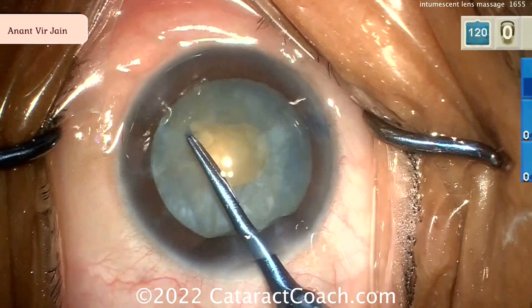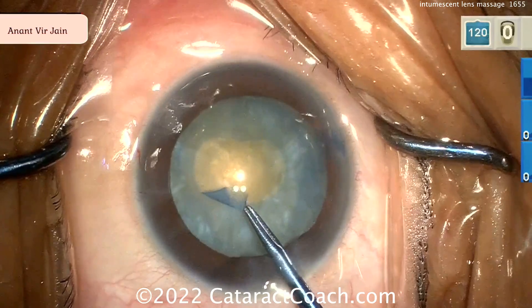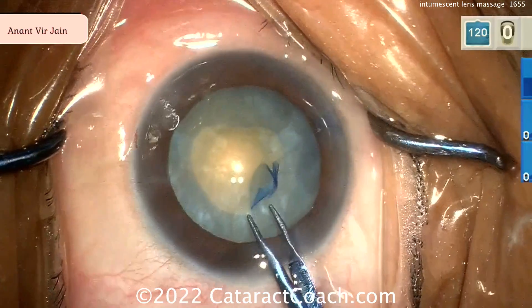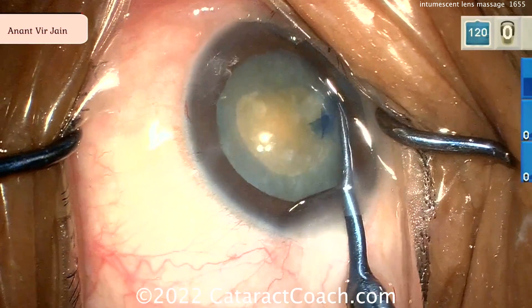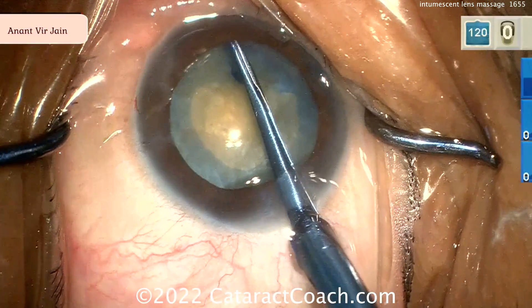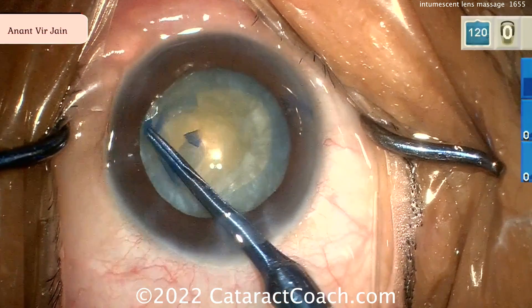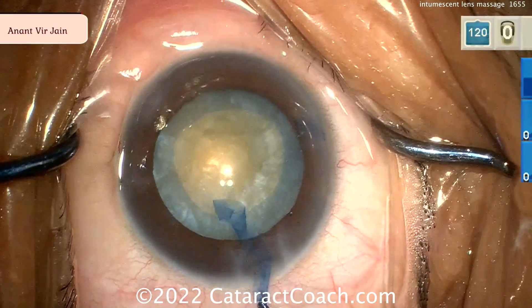Good question — hey, everyone loves a massage. But should you massage a lens capsule? I think it's a neat idea. I don't think there's a downside to it. The next time I have an intumescent case like this, I may want to consider that — just to push the fluid out towards the periphery to flatten that central lens capsule. Thanks for sending the video, and appreciate it.